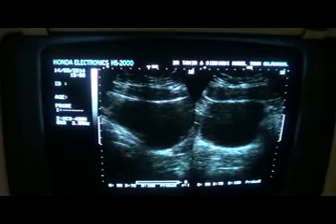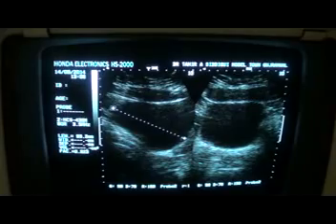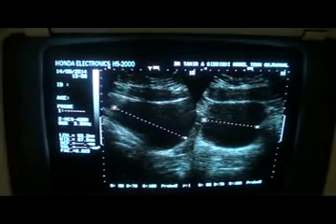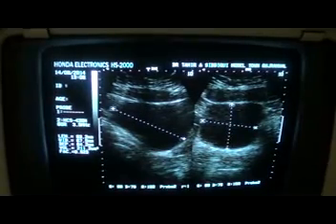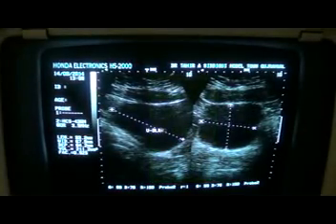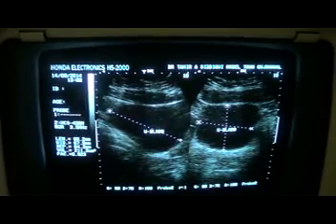And now I am going to calculate the approximate volume of the post-micturition residue. How much of the urine is remaining behind. More than 50 will be taken as not normal. So in this case, the urinary bladder is in post-micturition. The urinary bladder contains a urine volume of 211 ml. More than 50 is considered abnormal.